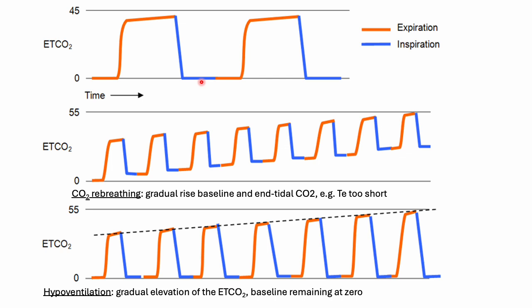So this is counterintuitive to what you see on the mechanical ventilator for breathing. Okay, so when you breathe out, your CO2 should be higher. Okay, and this is the point where we measure the end-tidal CO2. Then when you breathe in, it doesn't detect any high level of CO2 because during inhalation, there should not be any CO2 in it. Okay, and then the next exhalation starts, and then inhale.